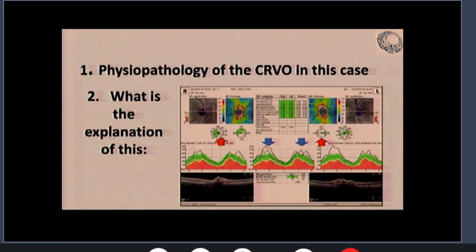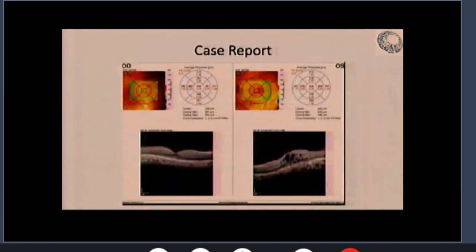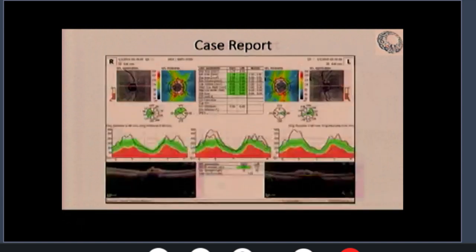Out, but on the top level. Remember that red will be lower, white is top. Why is it on the top in this case? Because we have an edema, secondary edema, clearly seen here. So you can imagine that that edema extends, and that's why it's over the limit. Yes?